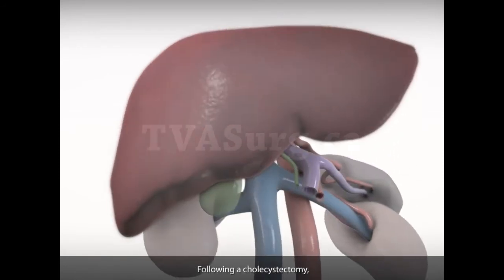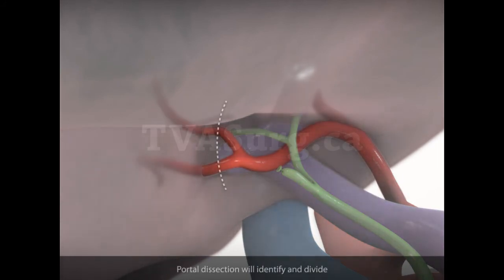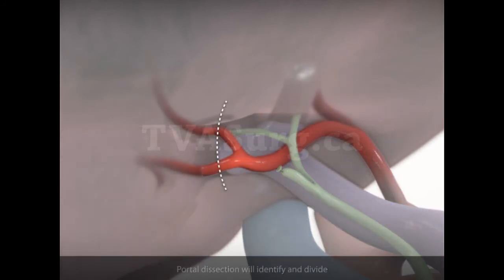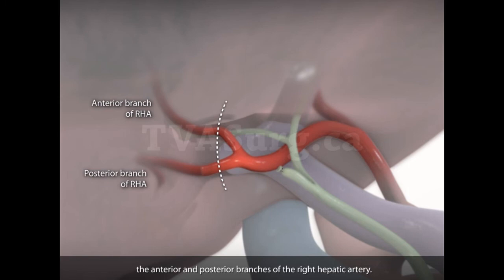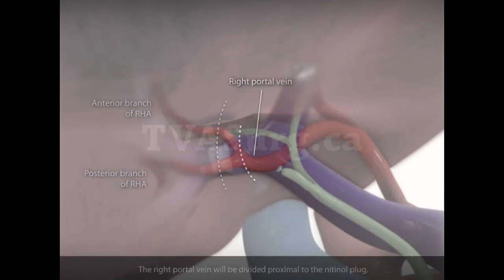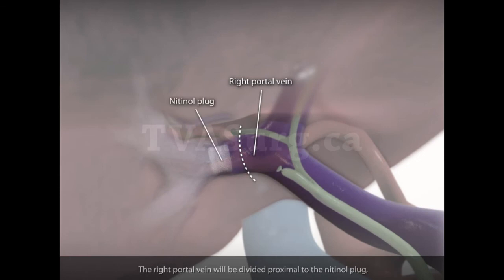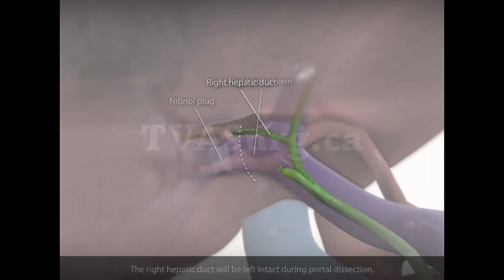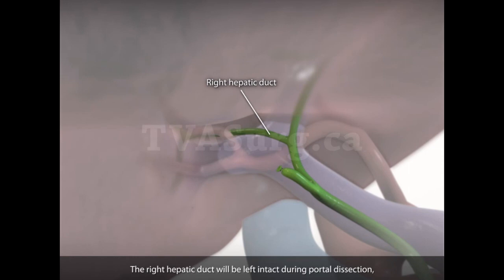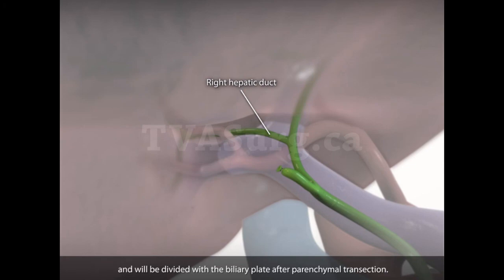Following a cholecystectomy, portal dissection will identify and divide the anterior and posterior branches of the right hepatic artery. The right portal vein will be divided proximal to the nitinol plug, which will be palpable just distal to the portal bifurcation. The right hepatic duct will be left intact during portal dissection and will be divided with the biliary plate after parenchymal transection.